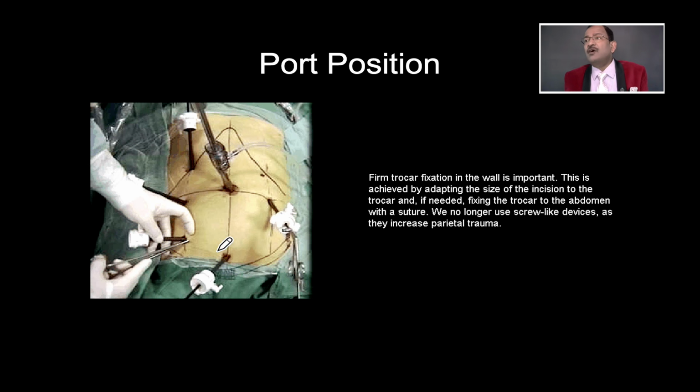And once the small bowel becomes dry, there is a chance of severe subacute obstruction, or at least very long duration paralytic ileus. And time to time, after every colorectal surgery, bariatric also, every 15-20 minutes to half an hour you should sprinkle some saline over the bowel loop, so that the serosa of the bowel never becomes dry.